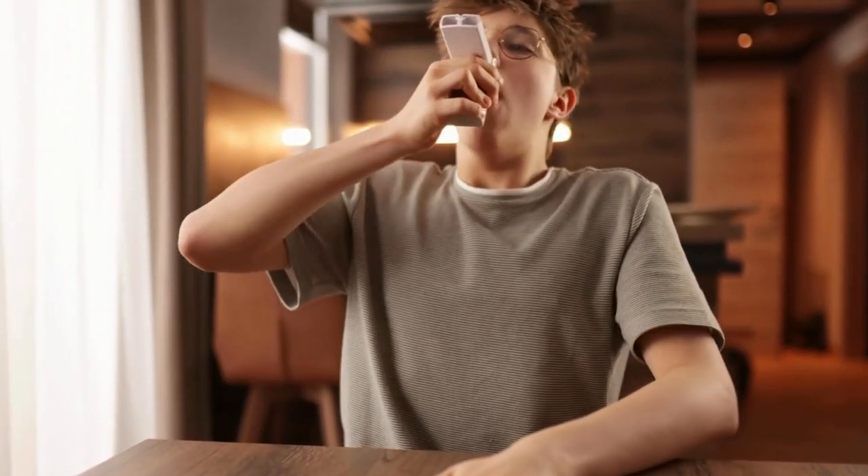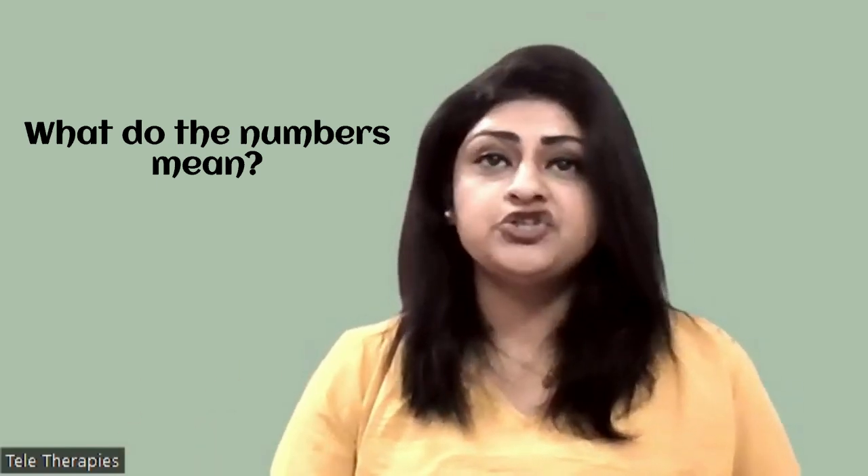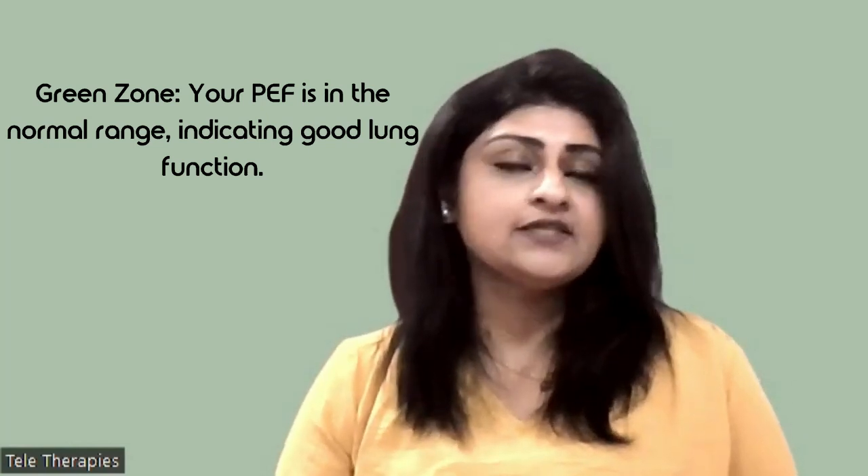Once you have measured your peak expiratory flow, what do the numbers mean? You would have been provided with a chart by your medical healthcare professional. Noting down your highest value on the chart will categorize your result into three zones: green, yellow, and red. Green zone: your peak expiratory flow is in the normal range, indicating good lung function.